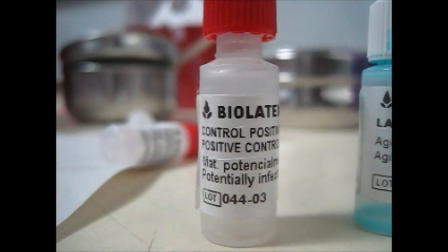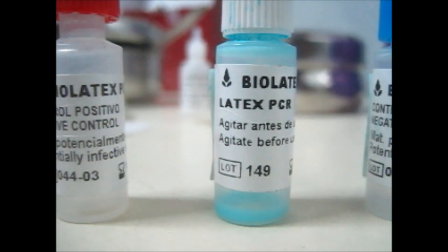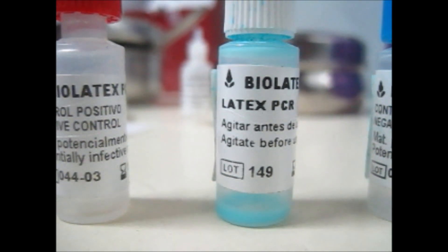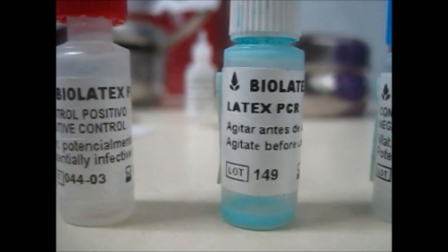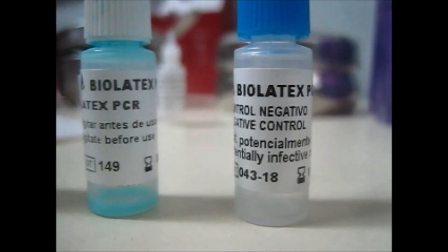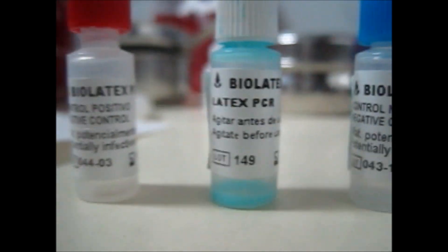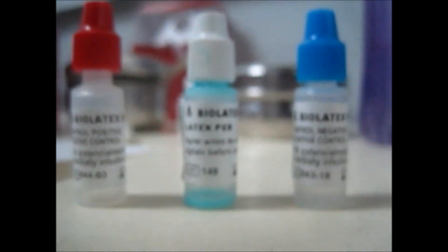Hi friends, today we're going to tell you how to check for C-reactive protein. Here we take three vials: the first one containing the positive control, the middle one having the latex PCR, and the third one having the negative control.